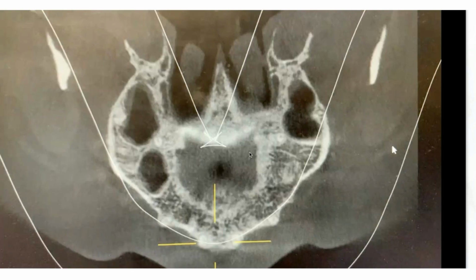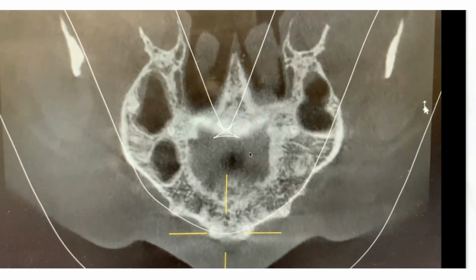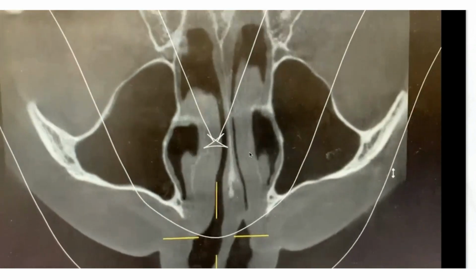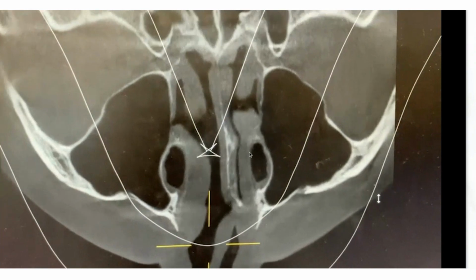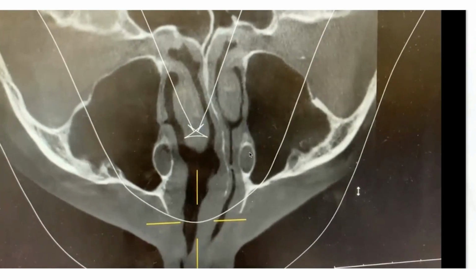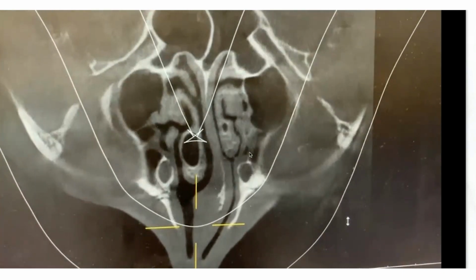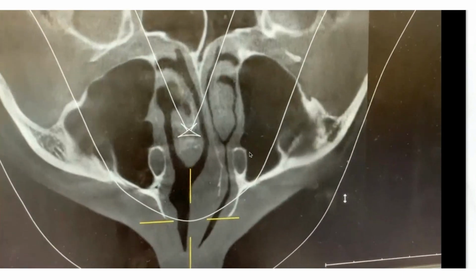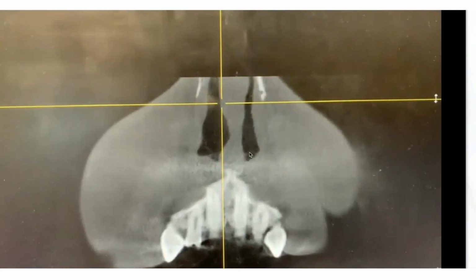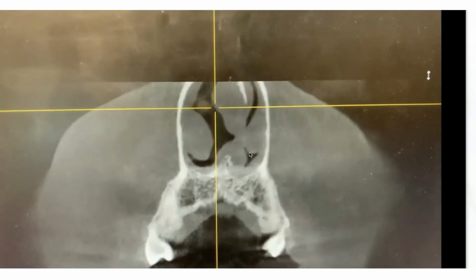And then here is a video to show a deviated septum. Again, those are turbinates that you're starting to see. Black is airway flow. And in this person's nose, I bet they don't breathe out of their left nostril at all. And the patients love it when I almost tell them their story. They're like, yeah, I can't breathe through there at all.